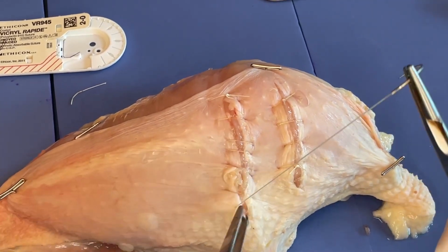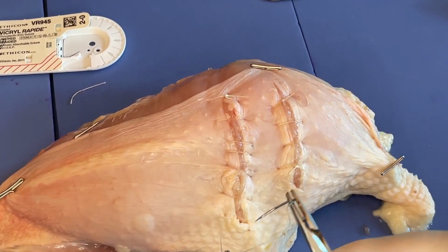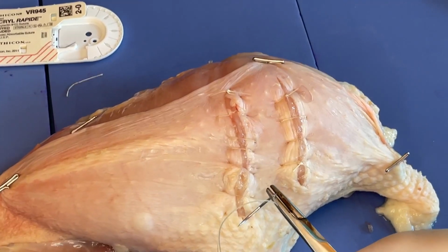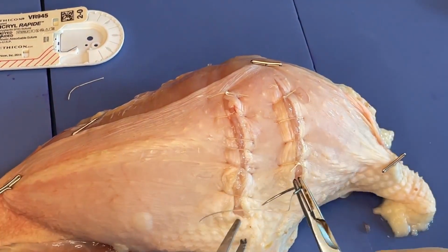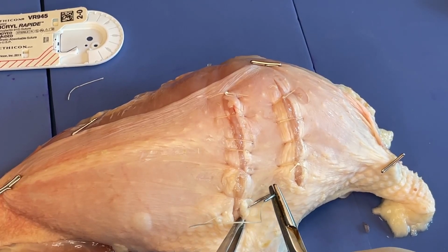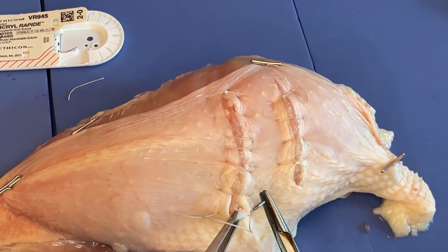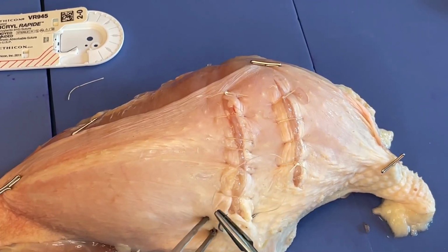All right, so now that we're getting towards the end of our incision, what I typically do, because again, we want to have both our first and our final pass of the needle and suture beyond the apex of the cut area. So I don't really feel like I have enough room here to do one more bite through the tissue and then one beyond.